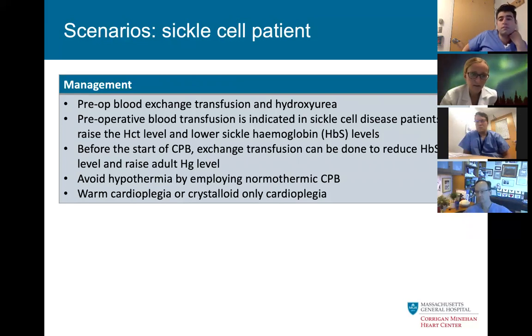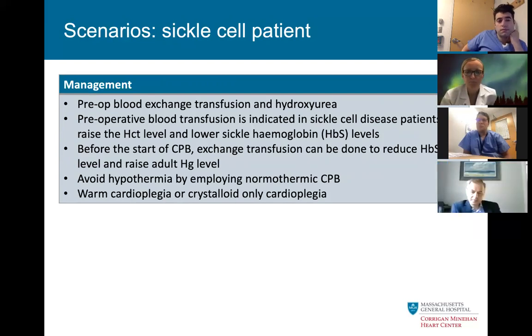So you have breaks. Yeah. The other thing is you may get some agglutination of red cells. You can actually see them visibly. The cardioplegia still works, and when you rewarm, they come apart. So you don't have to panic if you see that. Okay.